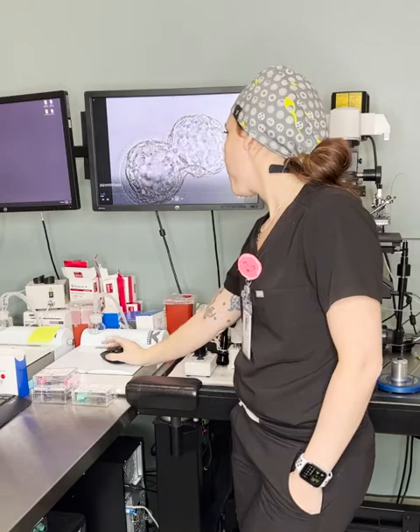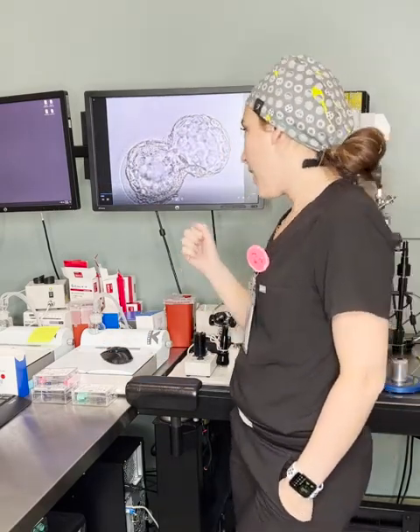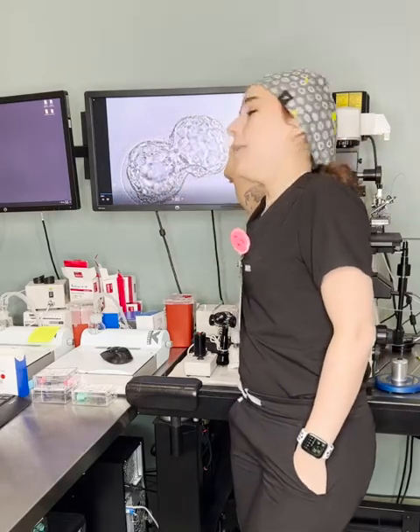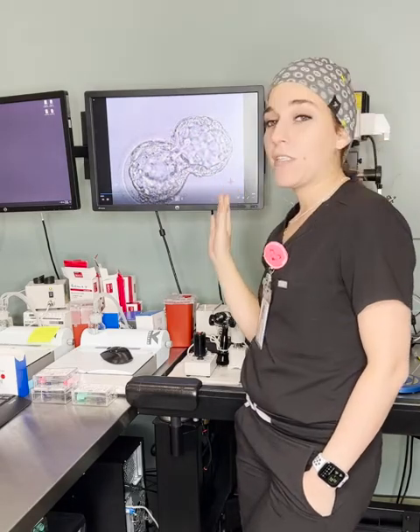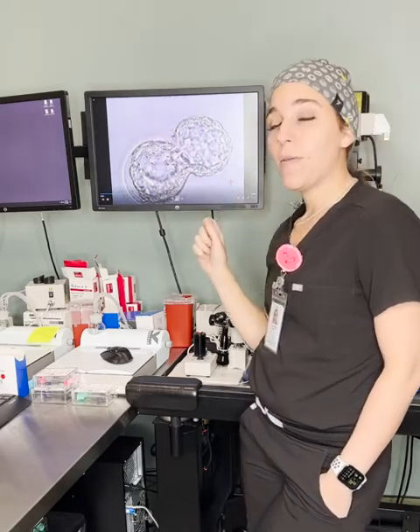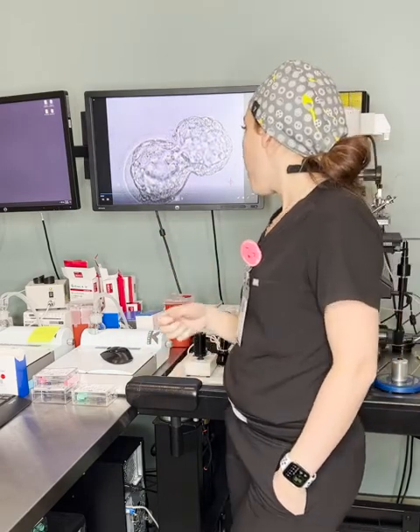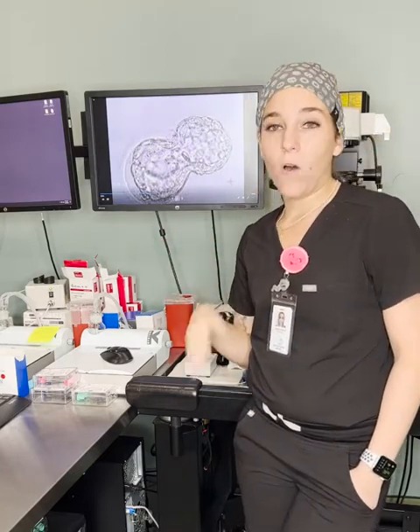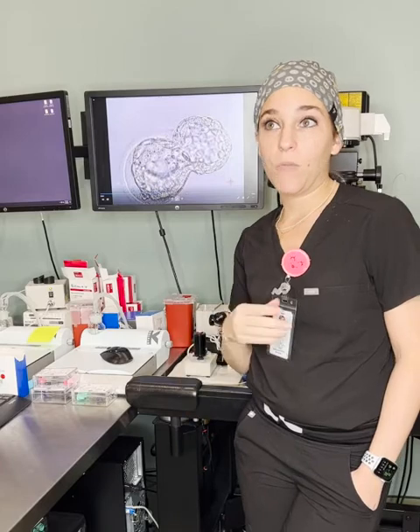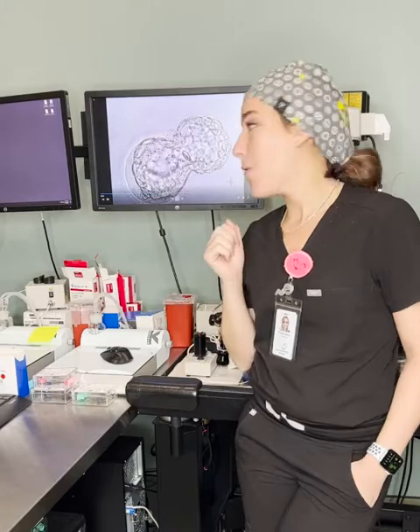So, this is a video of a blastocyst, like I said, that I am collapsing for freeze. So here's my laser right here. I'm gonna hit it once. I'm focusing right now on the edge. I'm gonna hit in between the cells once, and you are gonna see this embryo start to slowly shrink. So, it's already collapsing. This is done on most embryos prior to freezing, unless a patient specifically says they don't want assisted hatching, also known as collapsing. However, as you can see, it doesn't harm the embryo.